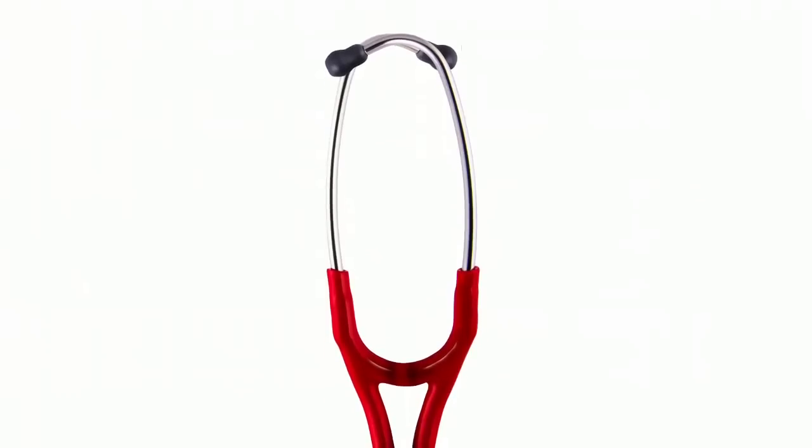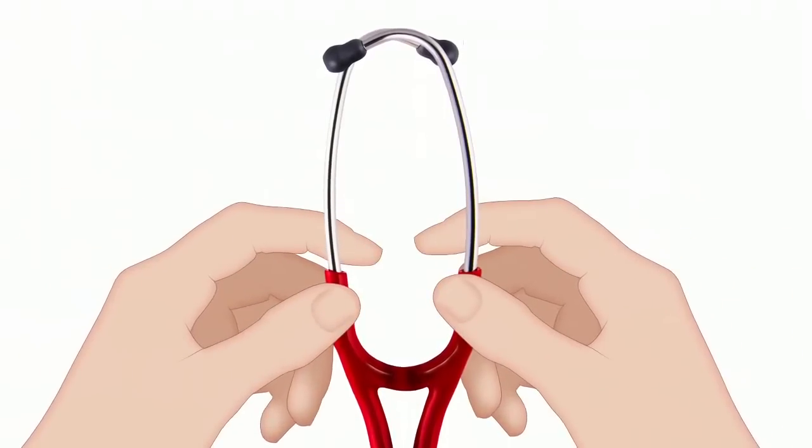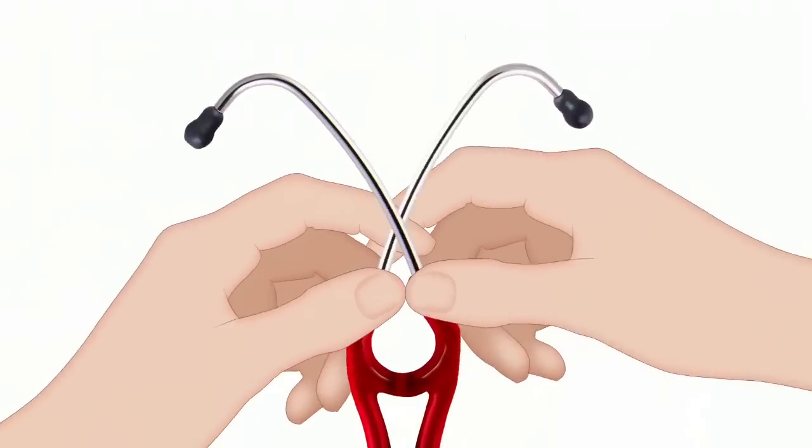To adjust the tension of the headset, hold on to both ear tubes and either pull them apart or squeeze them together.